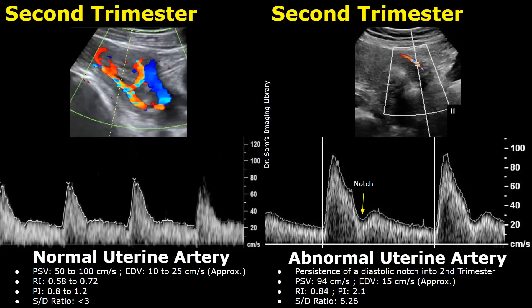In this example, the PSV is 94 centimeters per second and the EDV is 15 centimeters per second. But the resistive index is 0.84, which is abnormal as it is more than 0.72. The pulsatility index is 2.1, which is also raised. The SD ratio is 6.26, which is also elevated. So these three values are abnormal.